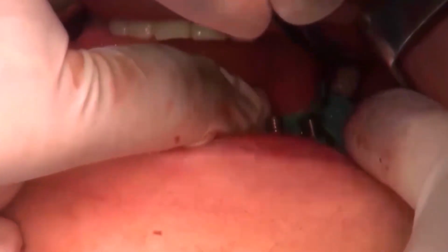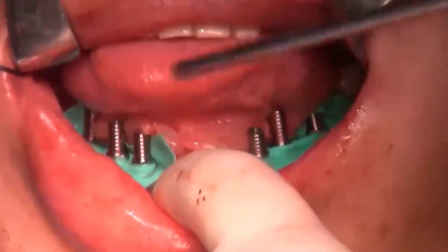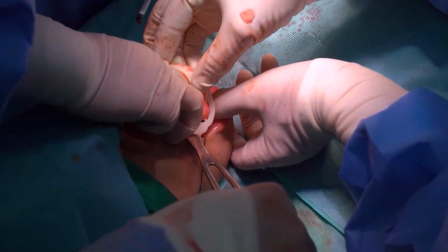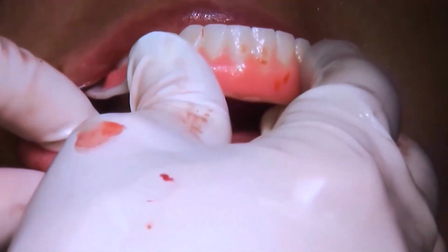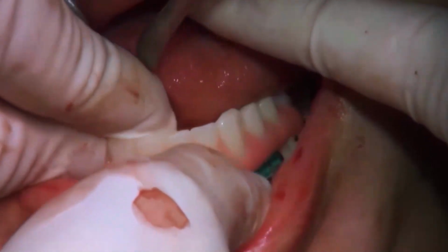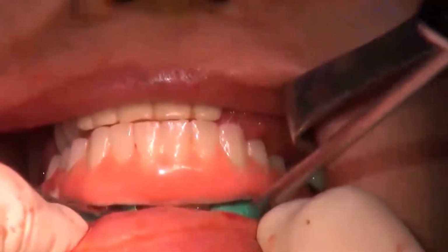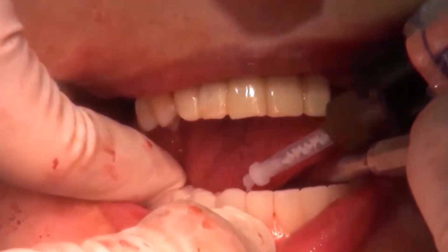After suturing, rubber dam sheets are placed beneath the cylinders. And then the provisional denture is placed in the mouth. And check whether the denture is placed in the right position by checking the occlusion with the opposite teeth.